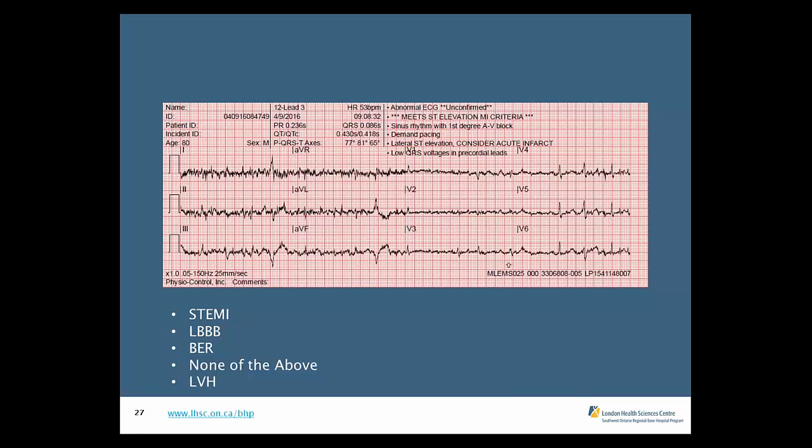Okay. Understanding that's a bit challenging sometimes. 94% of the audience recognized this, and again, why is the computer calling this ST elevation? Well, with that artifact, the computer is being tricked and can't discern what the ST segment is. It potentially is looking at a couple of those PVCs and saying that's what the ST elevation is.